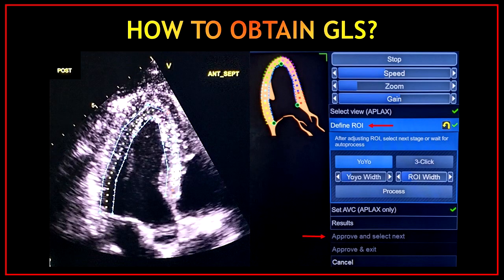Now that you have selected the view, the next step is to define the region of interest. Once again, the artificial intelligence will automatically track the left ventricular wall and the segments for you. If you think this tracking is accurate and you are happy with it, you can just click approve and select next. If you are not happy and the tracking is not accurate, don't worry — you can do this manually by clicking the three-click button.